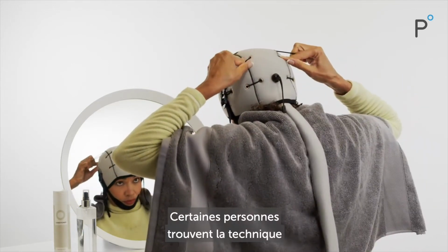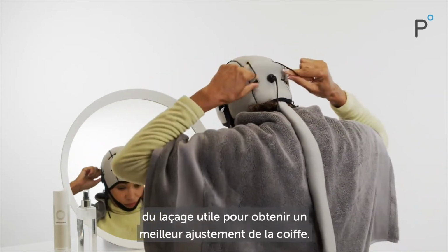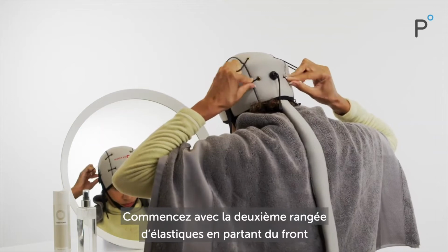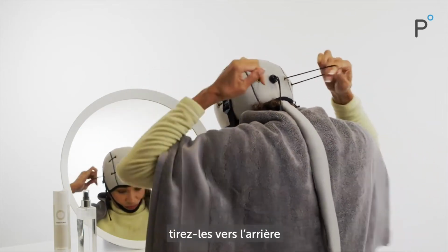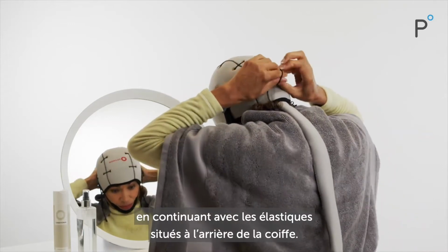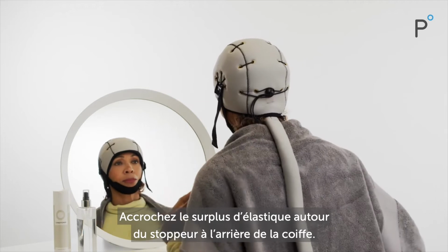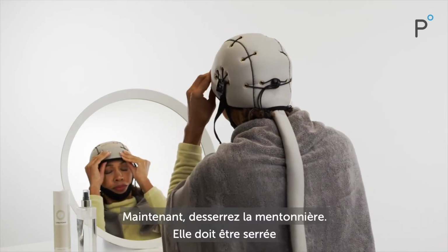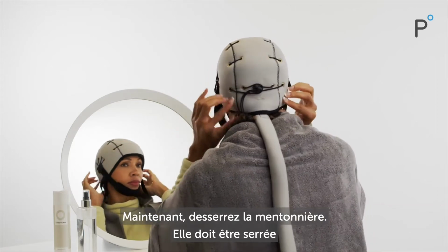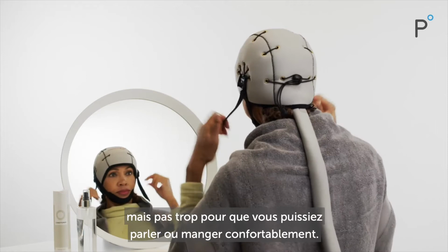Some may find the lacing technique helpful to achieve a better fit of the cap cover. Starting at the second set of bungee cords back from the forehead, pull the cords out and back, working along the cords towards the back of the cover. Hook the extra cord around the toggle at the back of the cap cover. Now you can loosen the chin strap so that there is still tension, but not so it is too tight for you to comfortably talk or eat.